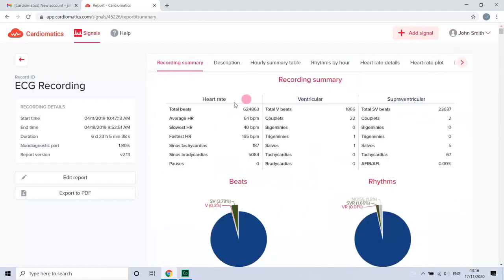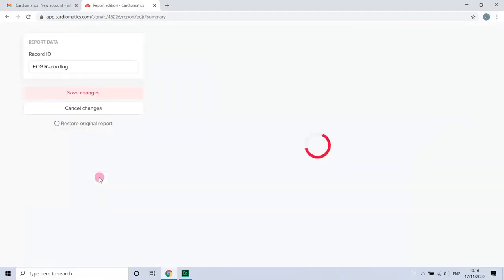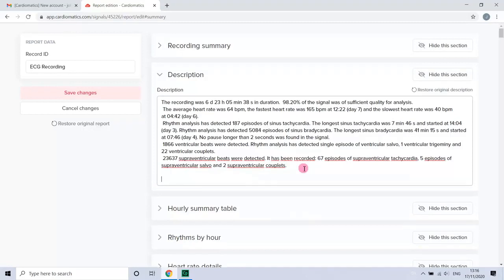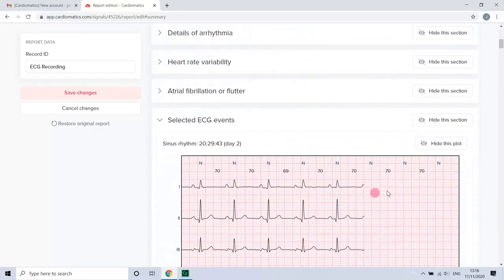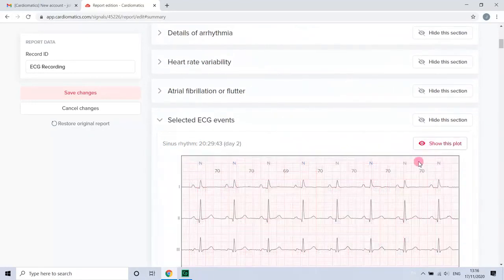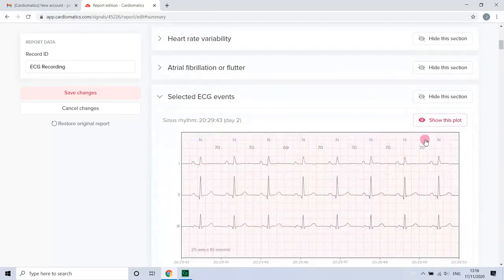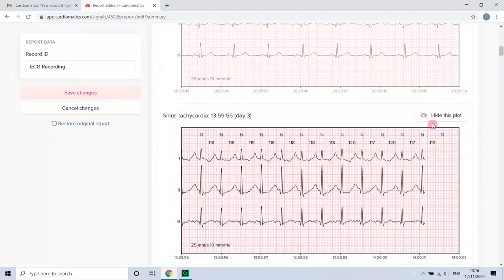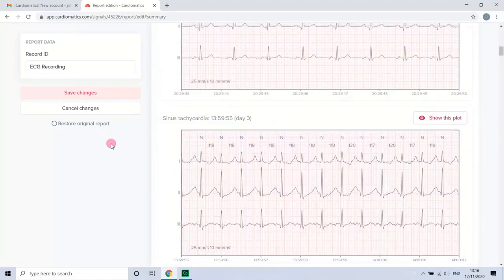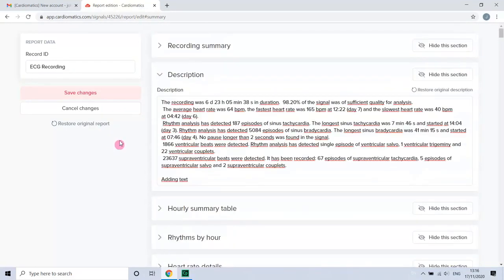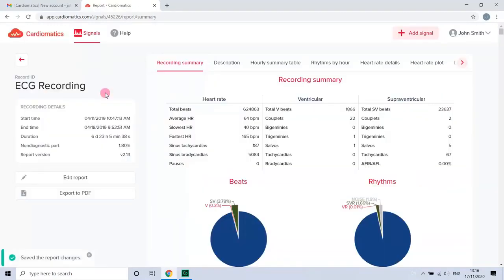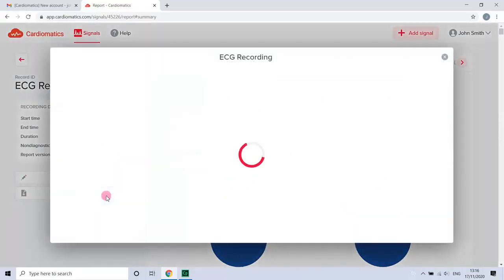You can edit your report. You can export it to PDF, download and print.